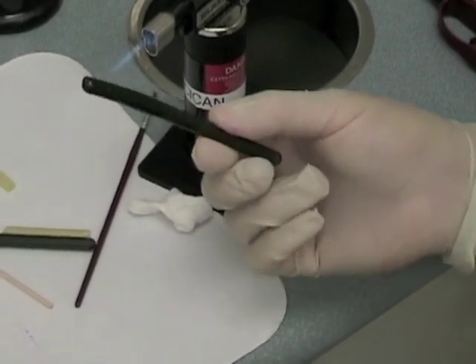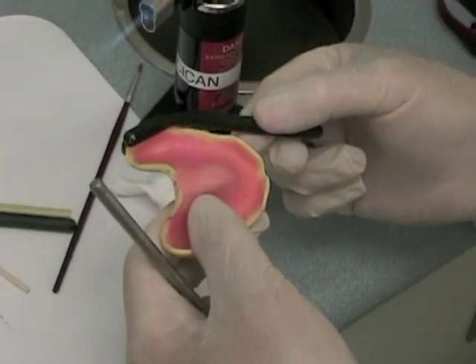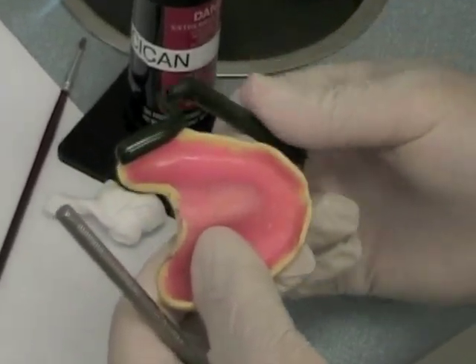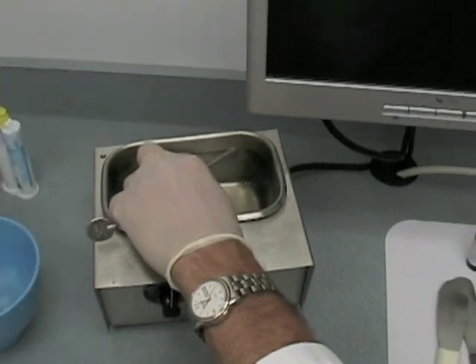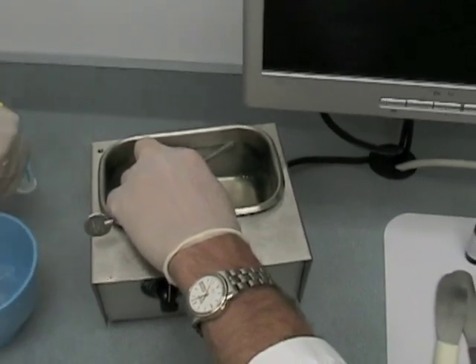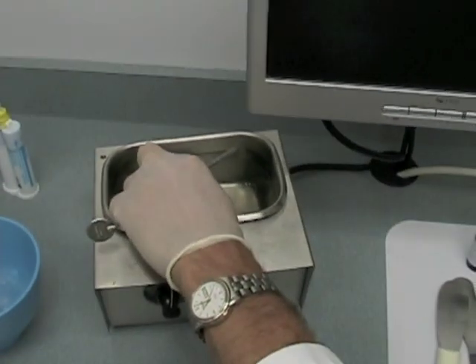Add it to the edge of the flange in a thickness just slightly thinner than the unwarmed stick. Temper the compound in the water bath so it does not burn the patient. The compound will stay soft as long as it is in the water. Try to keep the wax spacer out of the water so it doesn't melt.